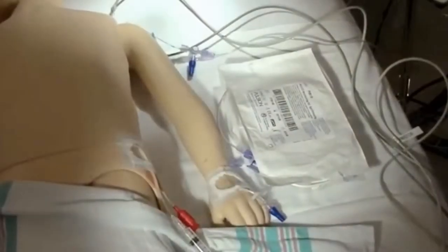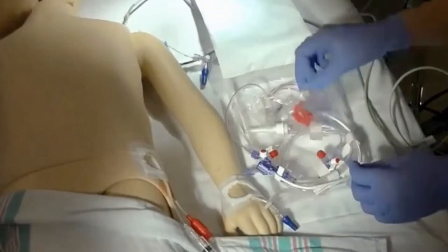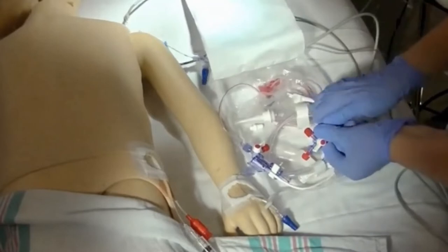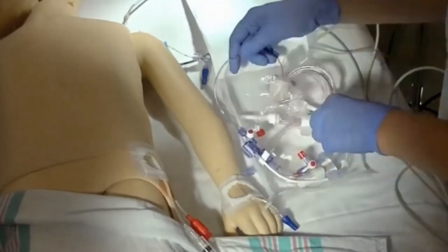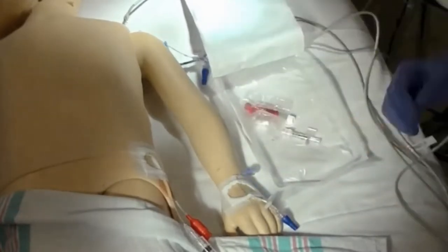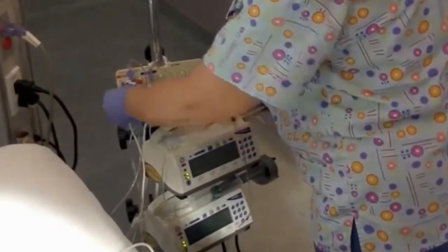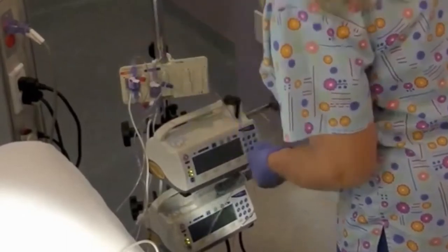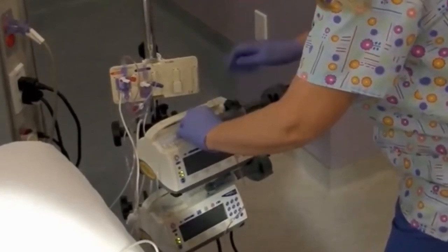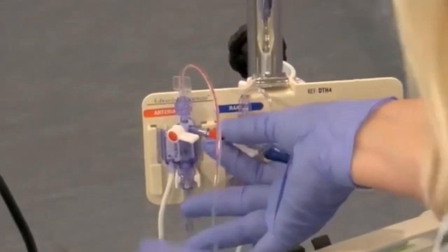Remove the PiCCO arterial transducer kit from the sterile package. Make sure all the connections are secure. Prime the transducer kit and attach to the heparin bag or syringe according to your facility's policy. Make sure all air bubbles are removed from the system. And finally, replace the vented caps on the side port of the stopcock with the non-vented caps included in the package.